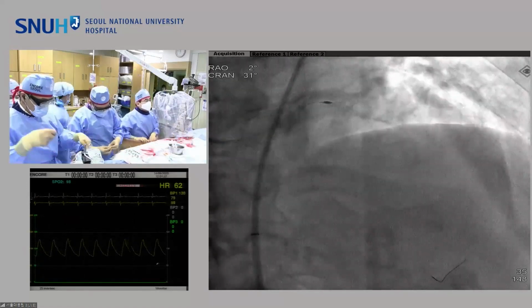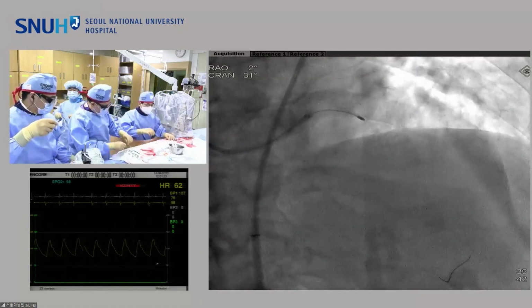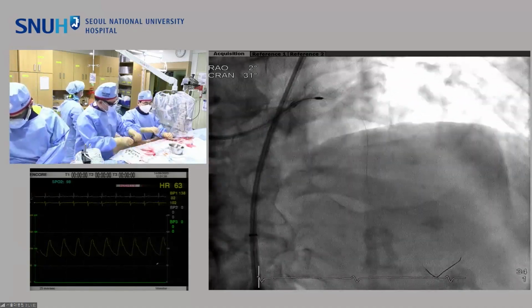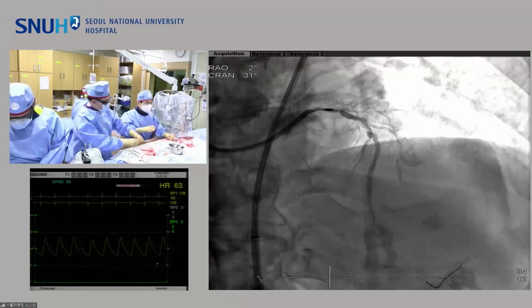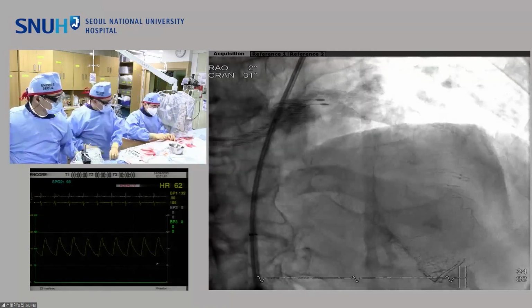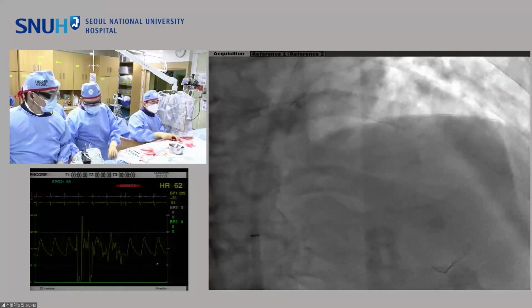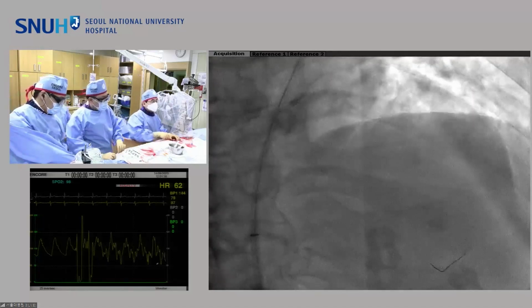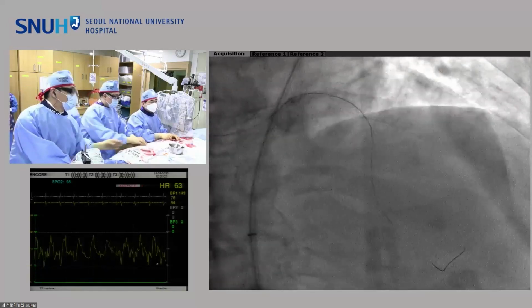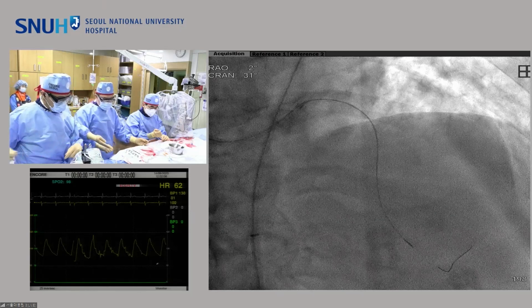I do not do ROTA ablation anymore in this case because of the angiogram. Actually, I do not do IVUS, but you probably want to see the IVUS finding. Okay. I think it would be very reassuring if we saw good cracks in the calcium. But it passed pretty easily, so that's good. Let's see, we get bigger than 1.5.